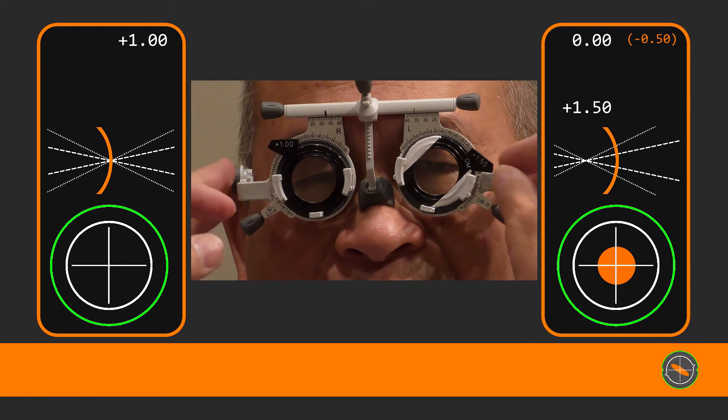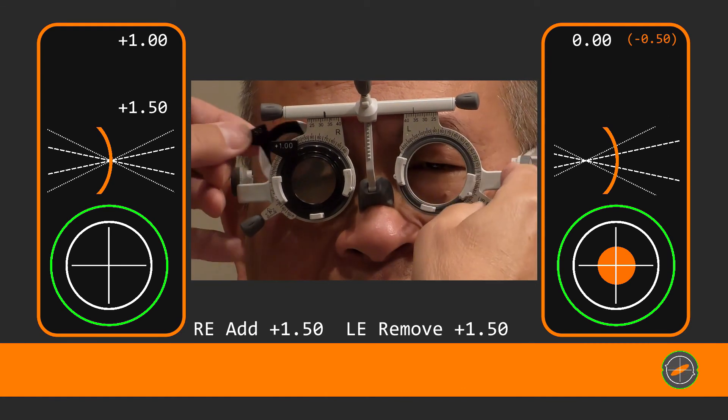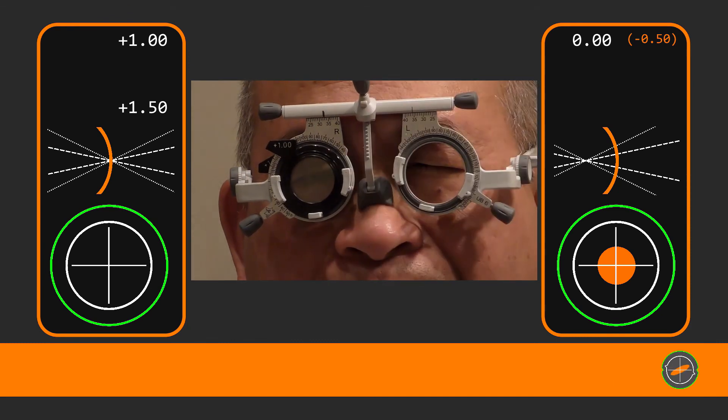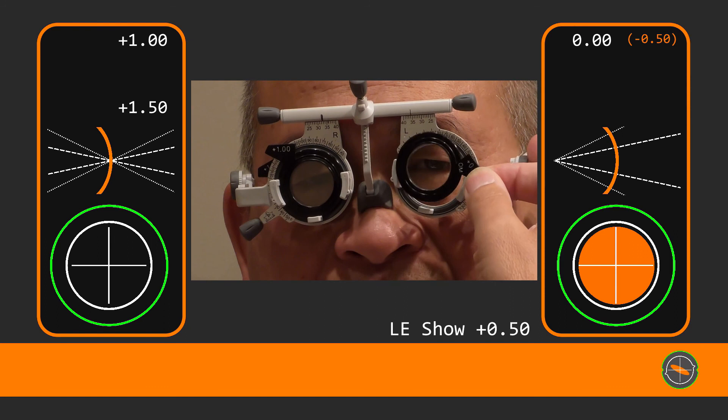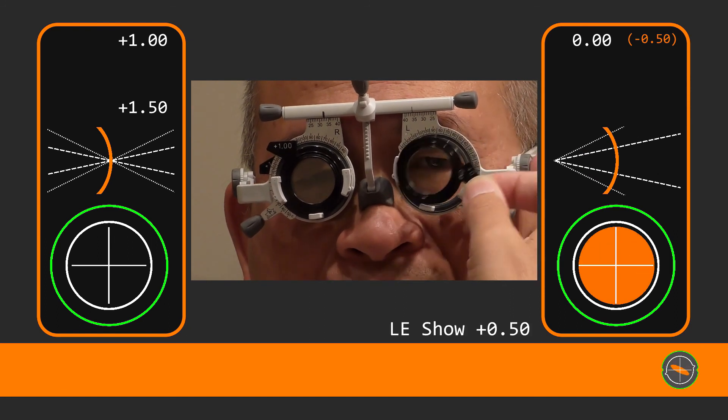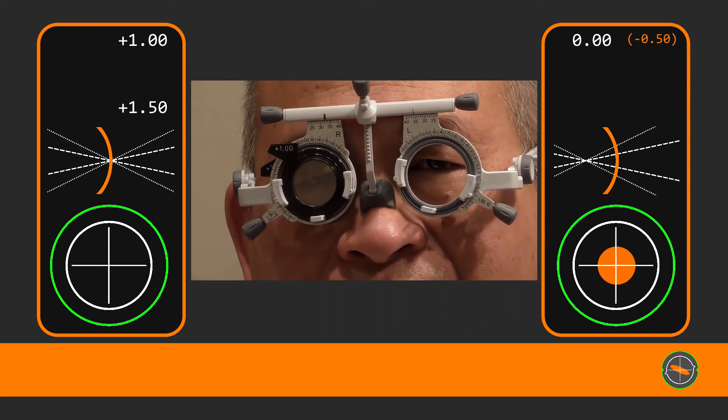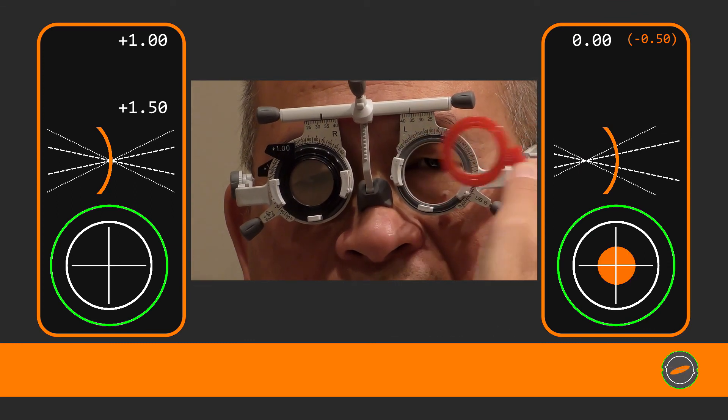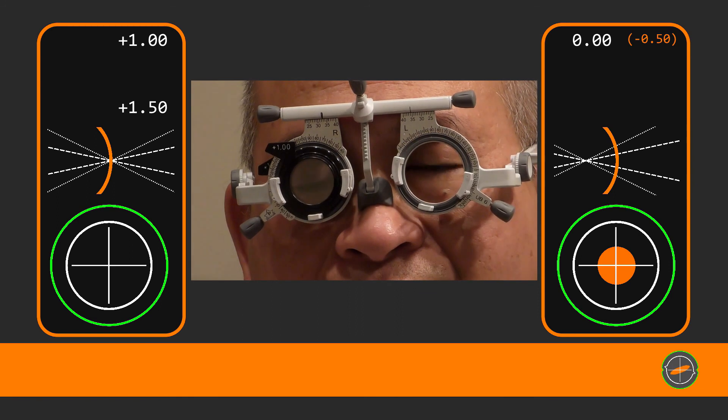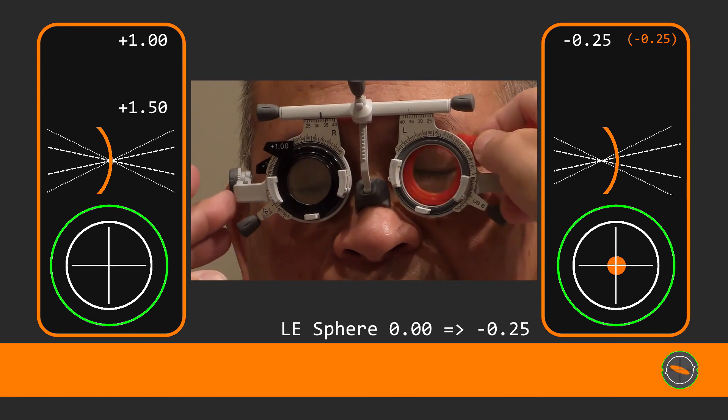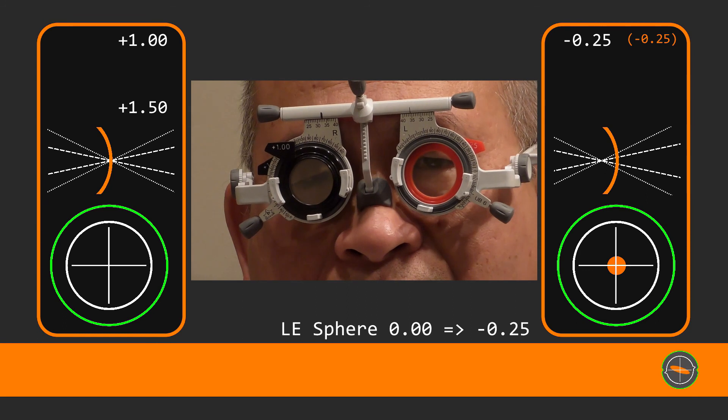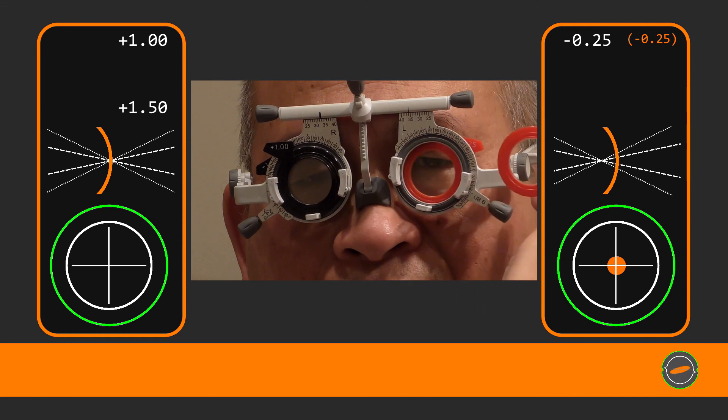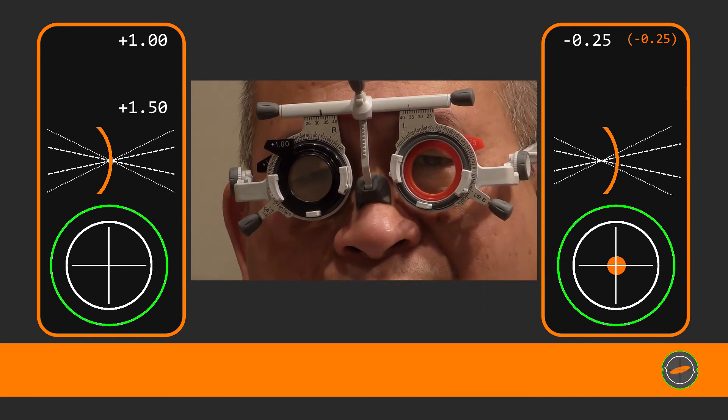Let's continue. Now let's swap this lens over to the other eye now. And that's a bit blurry there isn't it? And keep looking at that line there. Better with this one or better without. And better with this one. Better with.